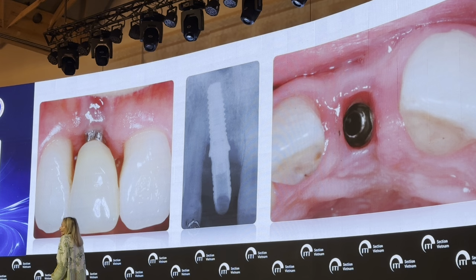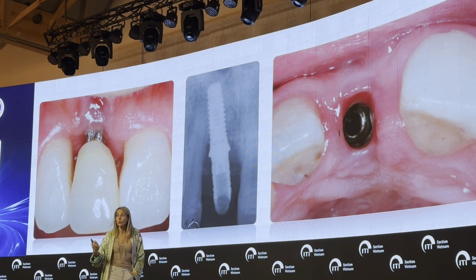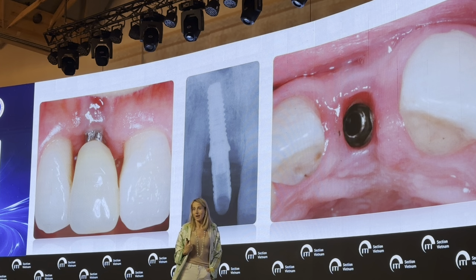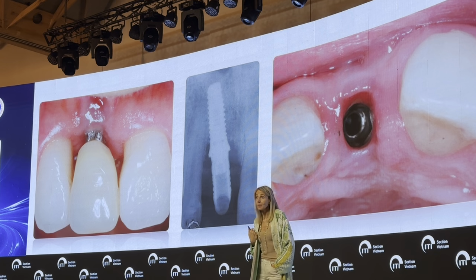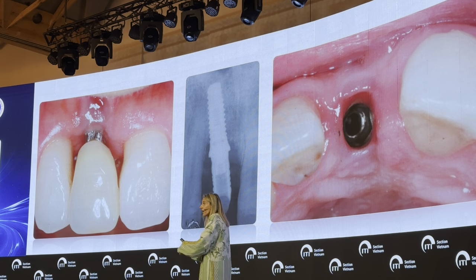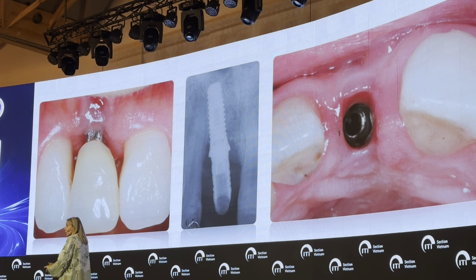Because if the patient asks for better aesthetics, the only alternative solution is implant extraction, but then it's not going to be an easier solution or an easier treatment plan, especially because these implants are well osseointegrated, so it's not easy to remove them in the majority of the cases. And then you have to deal with the lack of bone, the soft tissue management, a new implant. So it's something that requires a lot of time, skills, and money for the patient.